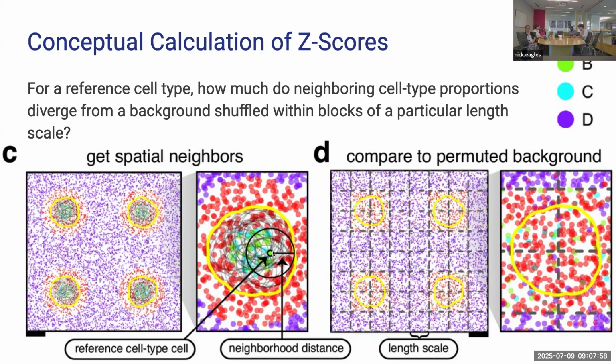They highlight one cell, but basically we're looking at a neighborhood of each of these cells. They show one of them at a fixed radius that you can specify, usually fairly small compared to the rest of the tissue. And we're taking the union of all of these neighborhoods. That's illustrated in this yellow circle. It's not a perfect circle because it's the union of many different spaces, so it's not guaranteed to be a circle by any means.